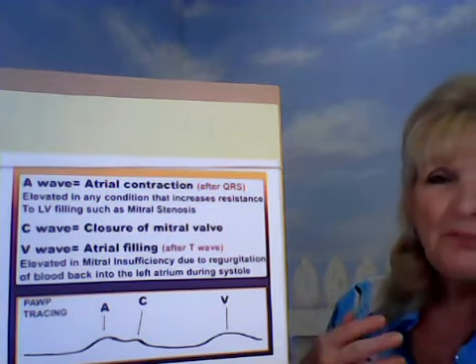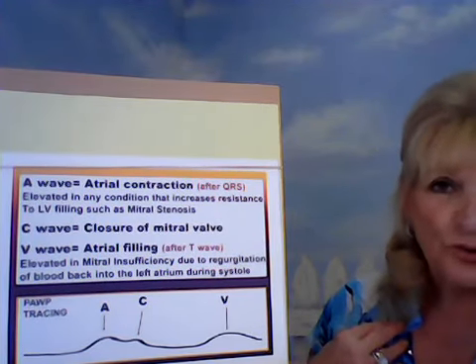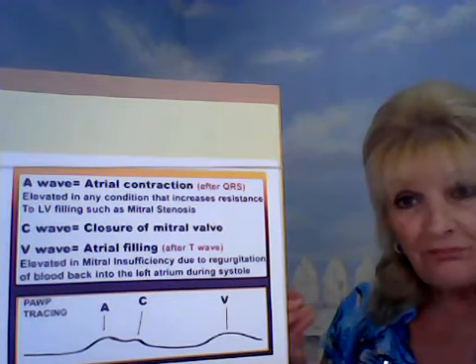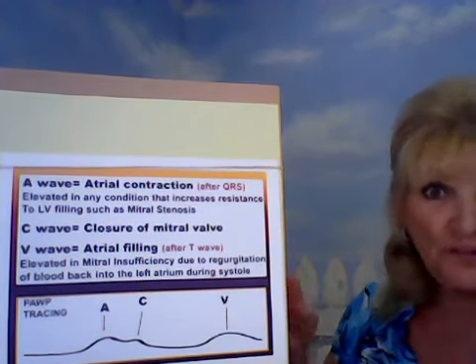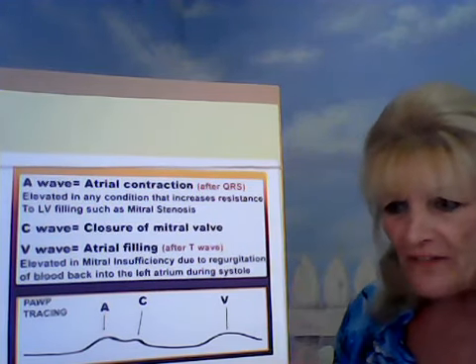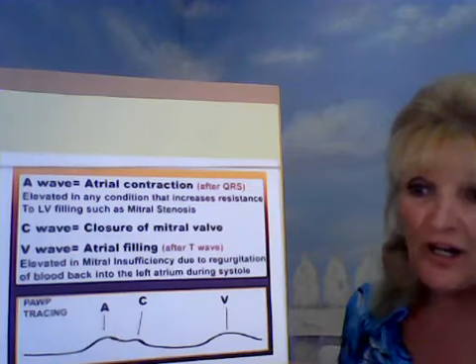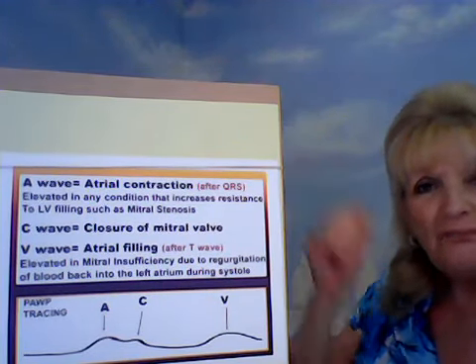When you're talking about someone with a Swan, they have tubing that comes from the insertion site, and that tubing usually goes down somewhere near the floor, and then it comes up, and then it's on the transducer, and after the transducer you have a wire that's definitely on the floor, and then the wire goes up to the EKG monitoring machine.